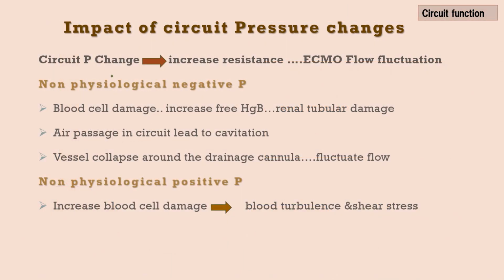Why do we monitor circuit pressure changes? Any increase in pressure in the circuit reflects increased resistance, so it will lead to ECMO flow fluctuation.